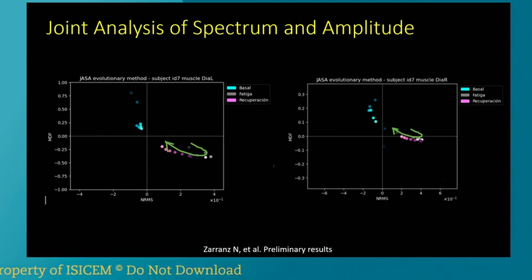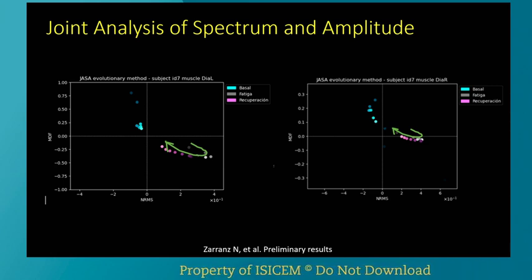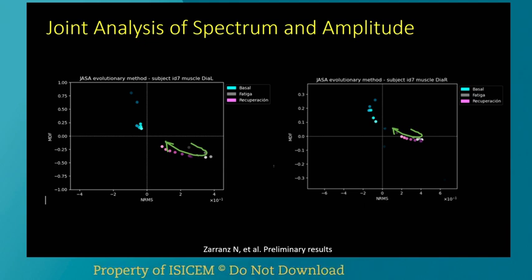So if we have to place a line, this is what happens over time in the left diaphragm and in the right diaphragm. So we bring them to fatigue, and then we let them start to recover. Of course, we make 10 minute measurements. So we expect that if we prolong the measurement, at the end they will be back again to the baseline position, right? So it seems that these longitudinal measurements could be useful in terms of detecting trends, which allow us to be more active earlier during the journey of the patient in the ICU.